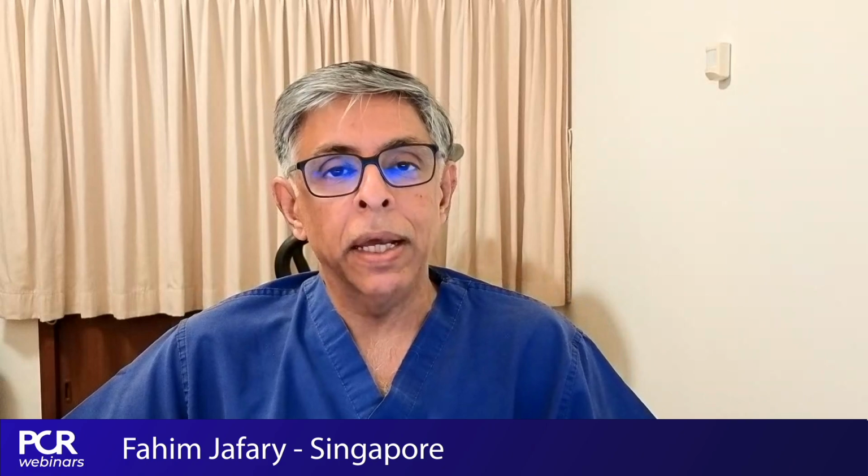On the other hand, if you get a good result, you're able to open it up, then all options are on the table. You can still DCB it, or you can just go ahead and stent. I think the crucial thing is preparation. If you obtain a stent-like result after big balloon and cutting or high-pressure balloon, then you just deliver the drug to the vessel, and this is okay. Otherwise, you better stent.